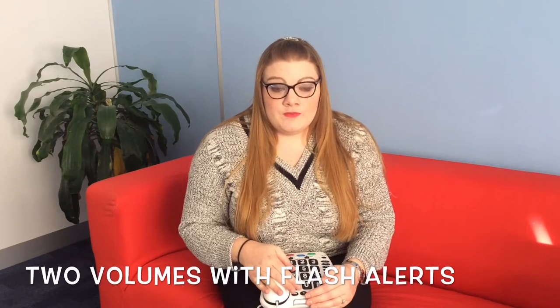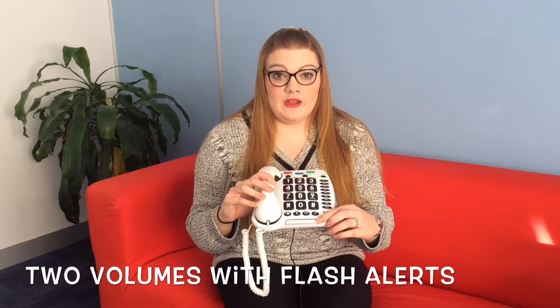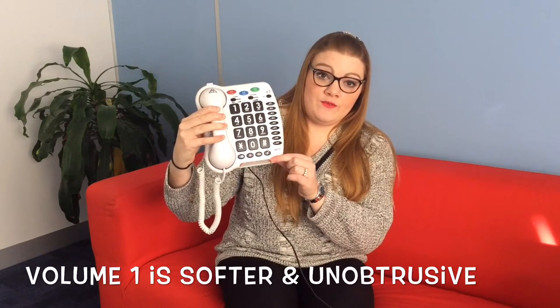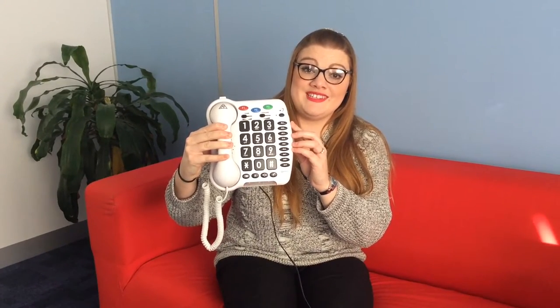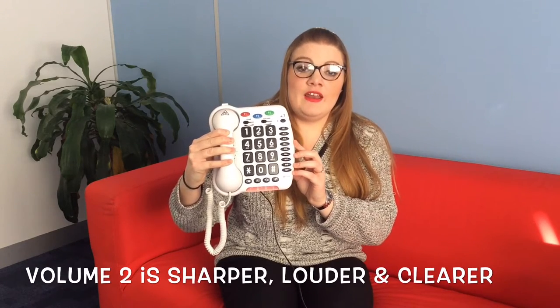The main feature I'm going to show you now is the volume level. You'll also notice when the phone rings that there's a flash as well to attract attention. At the lower level you should be able to hear it's quite a soft sound — not very obtrusive — and you can see the flash going off. Now I'll turn it up to the next level and you should hear a very distinct difference. At the higher level it's a much sharper, much louder, much clearer noise, which is really good for people who are hard of hearing.